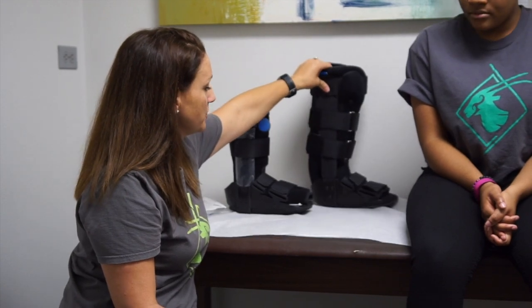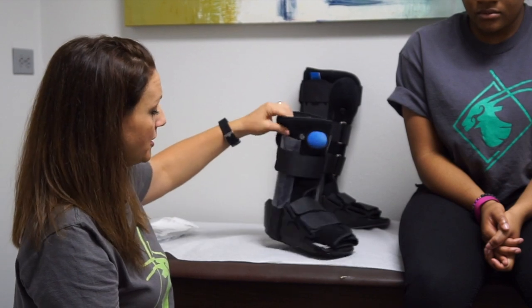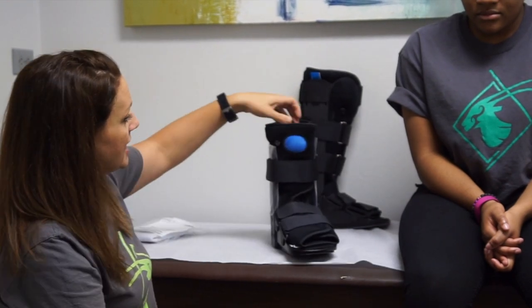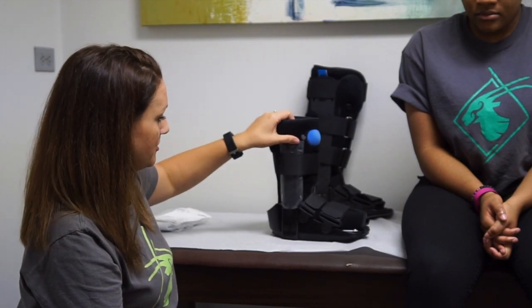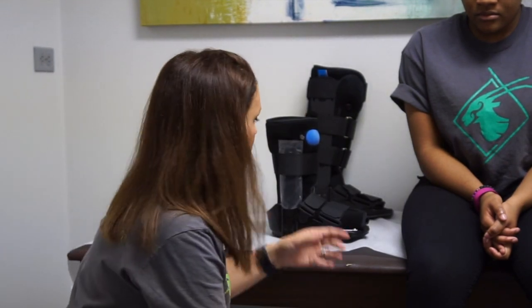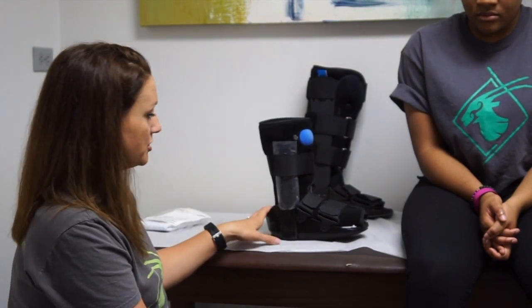These are for ankle fractures as well. Today we're going to show you how to use the pneumatic ankle walker by CoreFlex. As you can see, it has a little air pump with an air bladder — we'll show you how to use that in a minute — and it's pretty low profile. This is a size small, so we just determine by the size of our patient what size we'll choose.